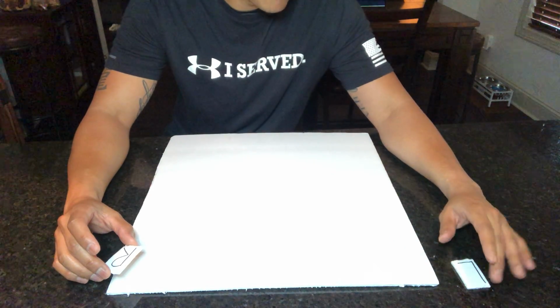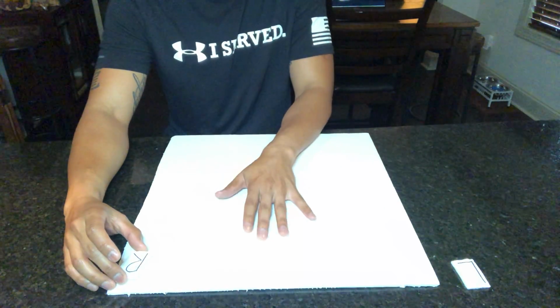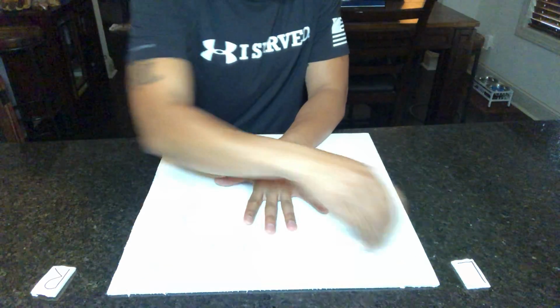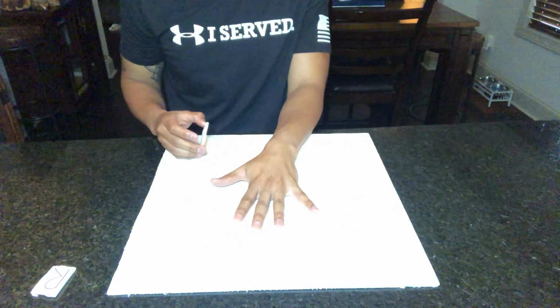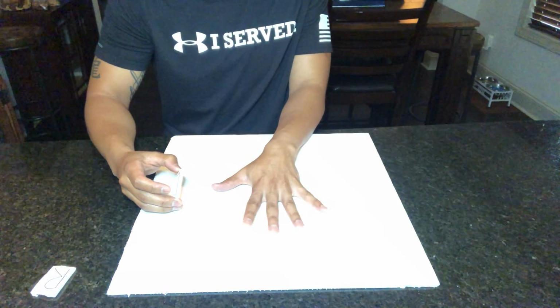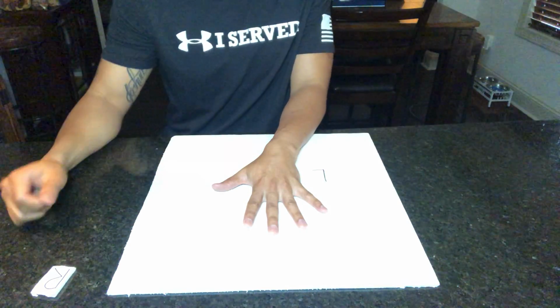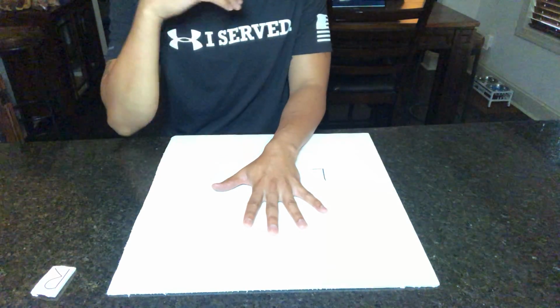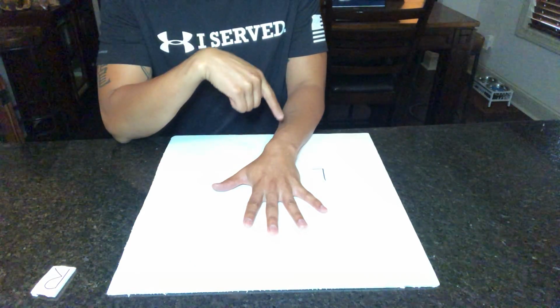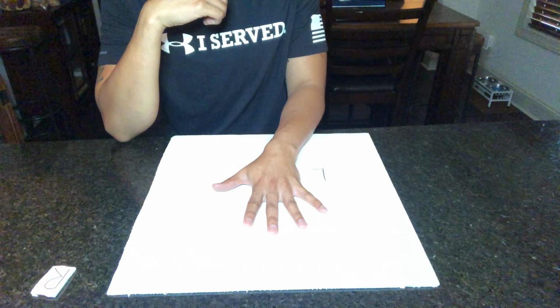I'm going to say that my left hand here is the affected hand. First projection is going to be PA hand. So we're going to have the patient seated, hand placed, fingers slightly spread. Put the marker down here, left marker. And this is a 40 SID. We're using a 10 by 12 cassette.